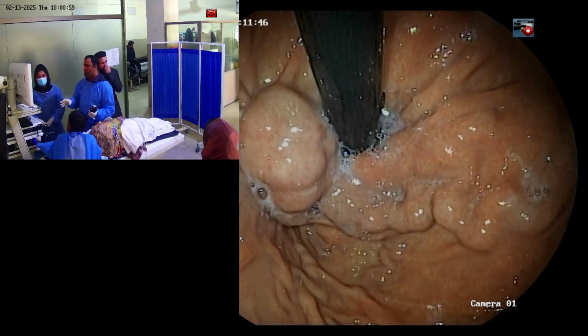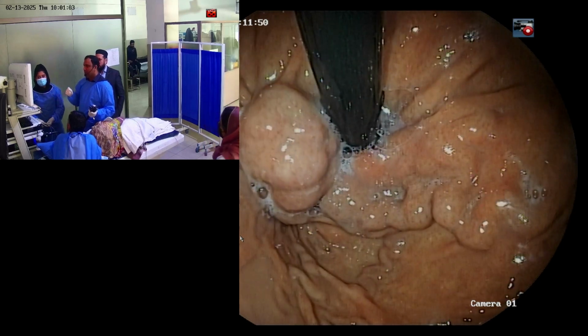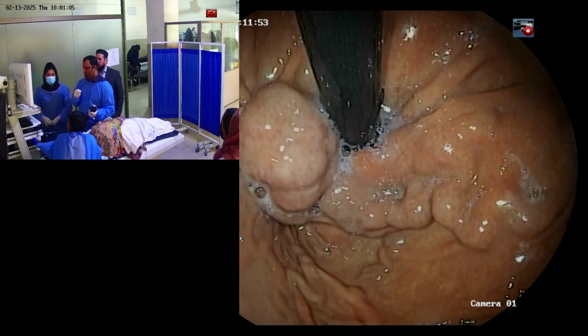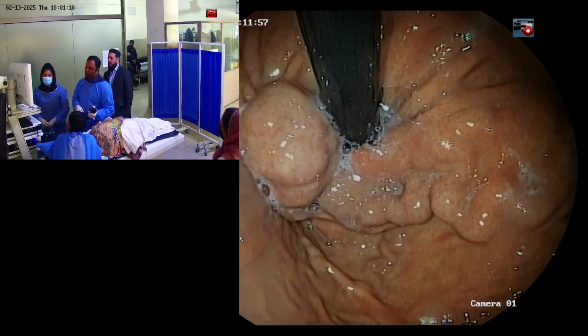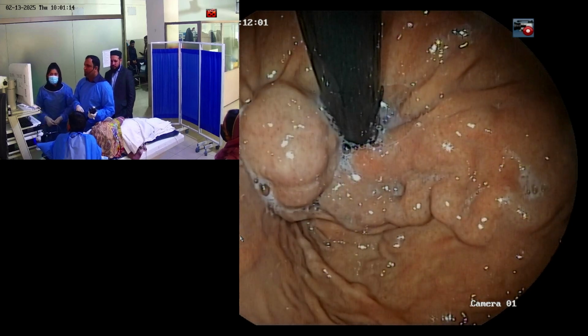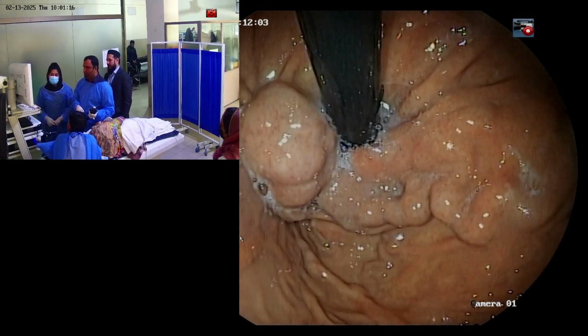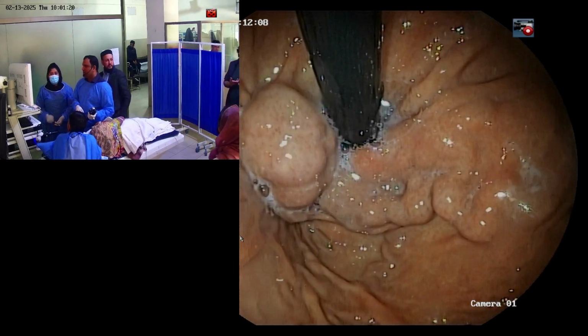Dilution was meant to delay polymerization with N-butyl cyanoacrylate, to avoid early polymerization in the needle. And because it's radiopaque, you can follow fluoroscopically with the obliteration of the varix. If you do imaging in such cases, you can always find small asymptomatic emboli, but the patients are asymptomatic.